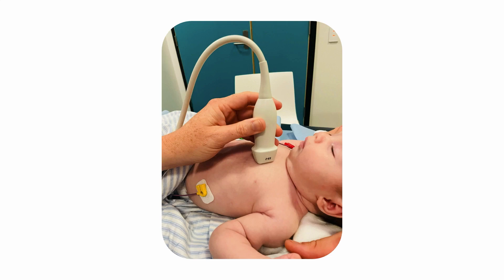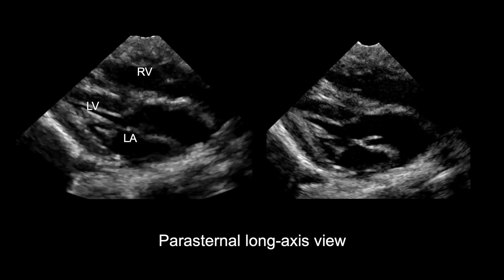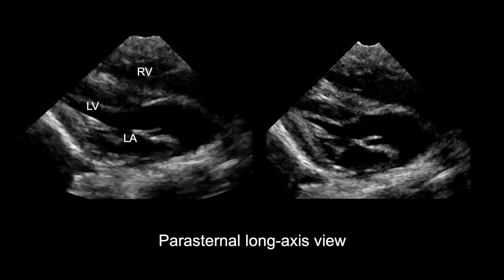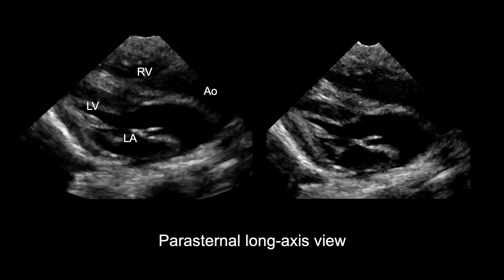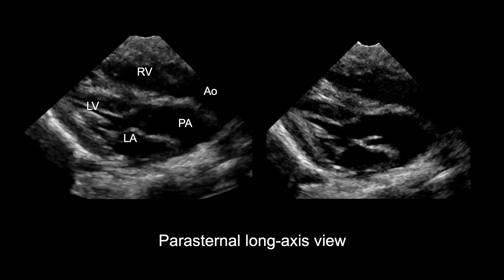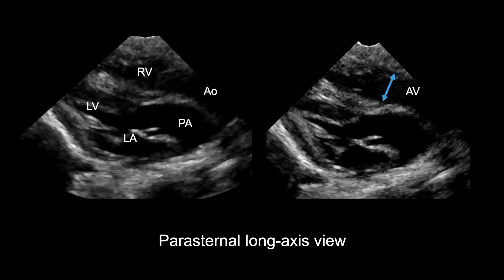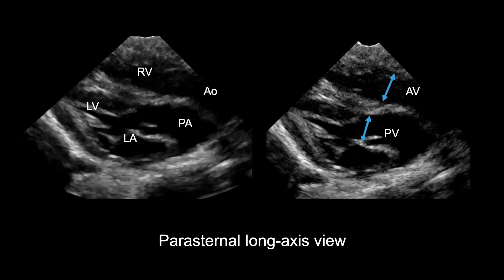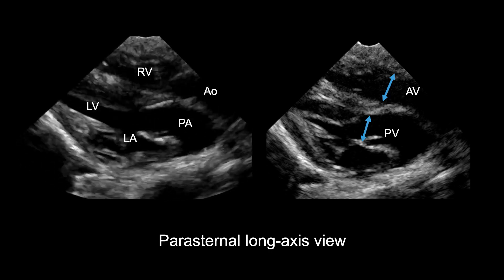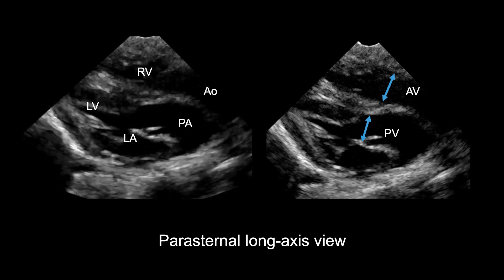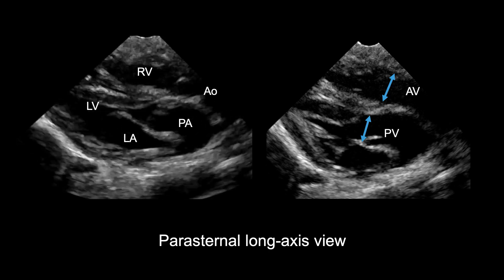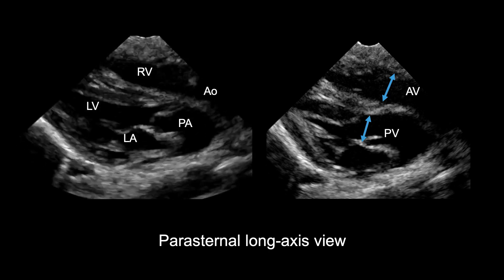Firstly, assess the size and position of the great arteries. To do this, we'll use the parasternal long axis view. Here's an example with the aorta and the pulmonary artery visible. Measure the size of the aortic valve and pulmonary valve in systole with the valves open, as seen in the still image, and comment on any size discrepancy between the outflow tracks.